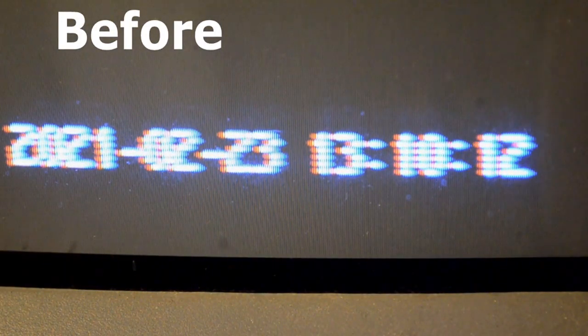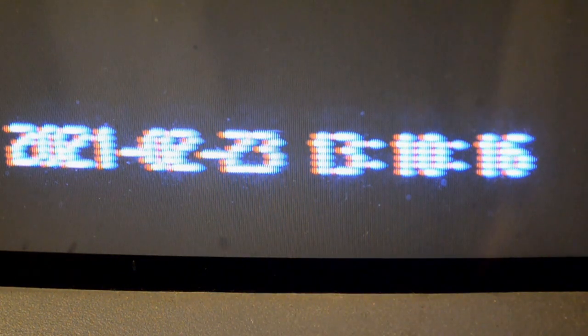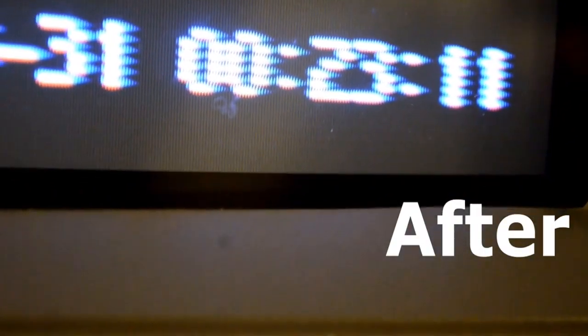Again, this is before I did any adjustments or any kind of capacitor replacement. A lot of convergence in this corner. And then after, now it's not perfect. You could still see some blooming on the edges where it blooms off to the right a little bit, but it has got to be 300 or 400 times better than what we started with. And I ran up smack against the wall here.